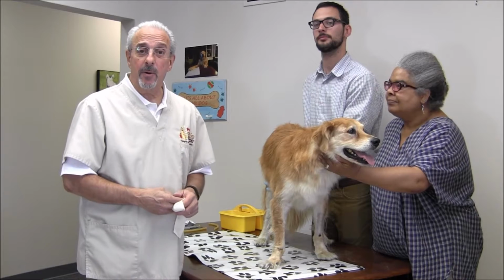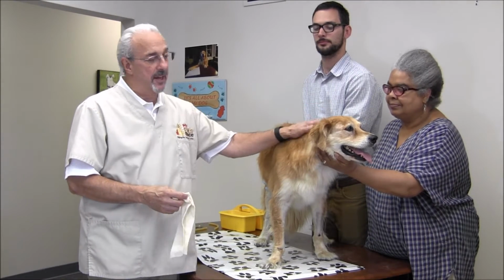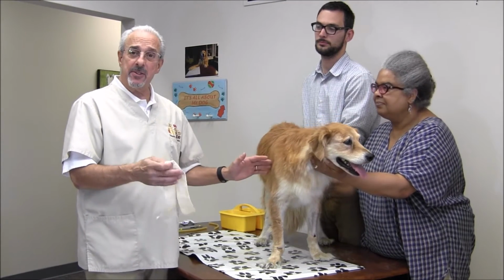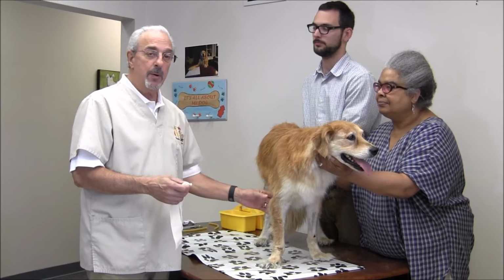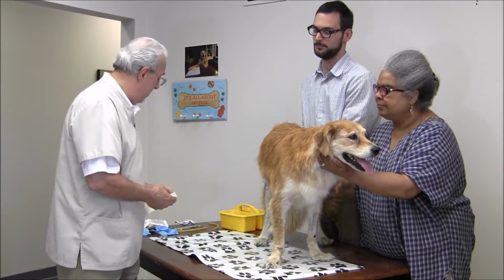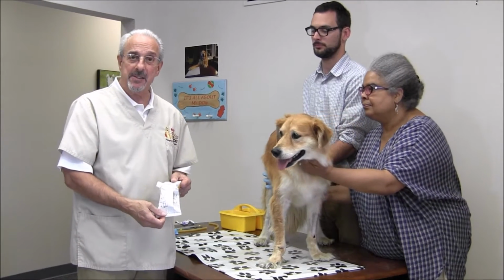This is Jim Alimo, and today we're going to take a cast for an elbow brace. This is Cleo. And the first thing that we want to remember is, let's cast the dog standing up. And when we cast, we want to get as high up into the axilla as possible. And we also want to make sure that we use the appropriate size casting tape.